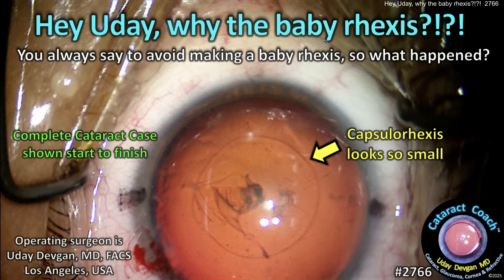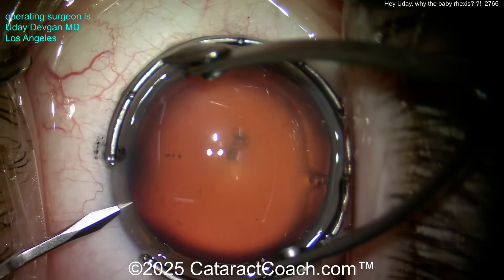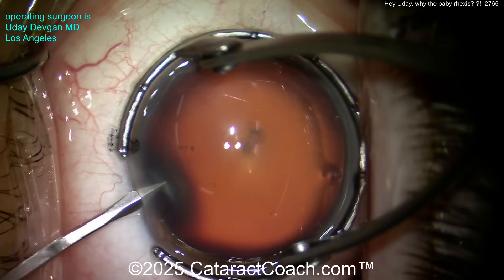CataractCoach.com — hey Cataract Coach, why the baby rhexis? You always say to avoid making a baby rhexis, so what happened? I'm looking at that rhexis, it looks kind of small. Well, watch this case carefully.